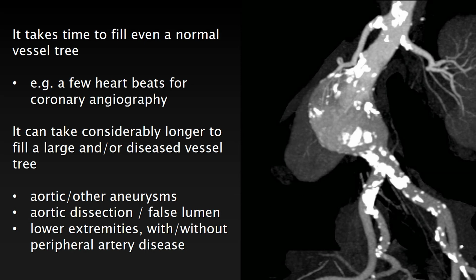The patient had in fact a prior body CT where an abdominal aortic aneurysm was noted, and then the patient was referred for a planning CT to do a CT angio. We had just gotten a 64-row scanner, and we started to scan immediately once the contrast arrived, and we scanned in, I don't know, a few seconds, and we noticed that the enhancement of the aneurysm was in fact much worse than on the initial outside body scan.